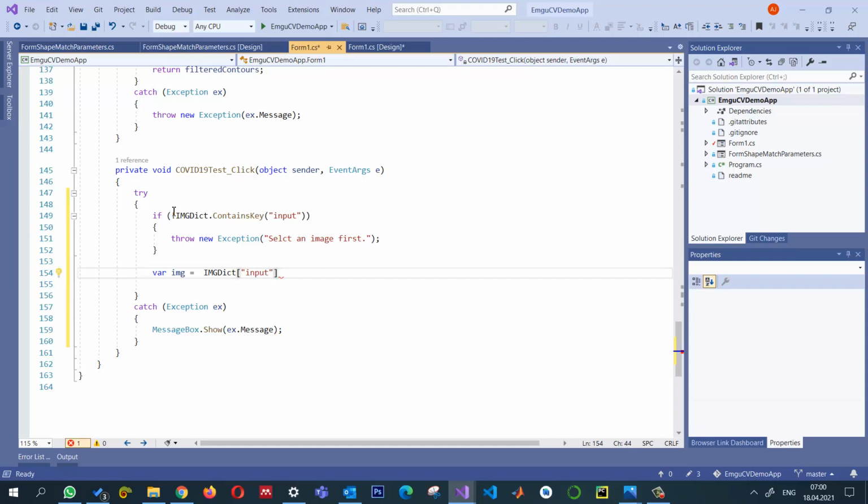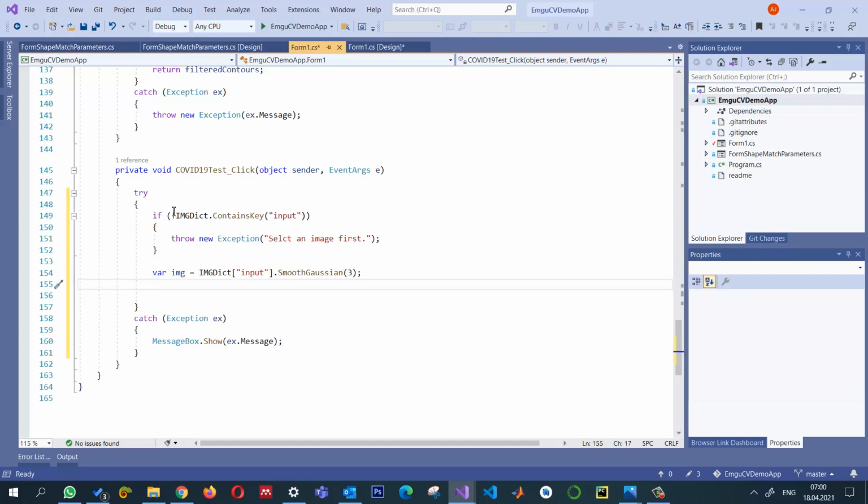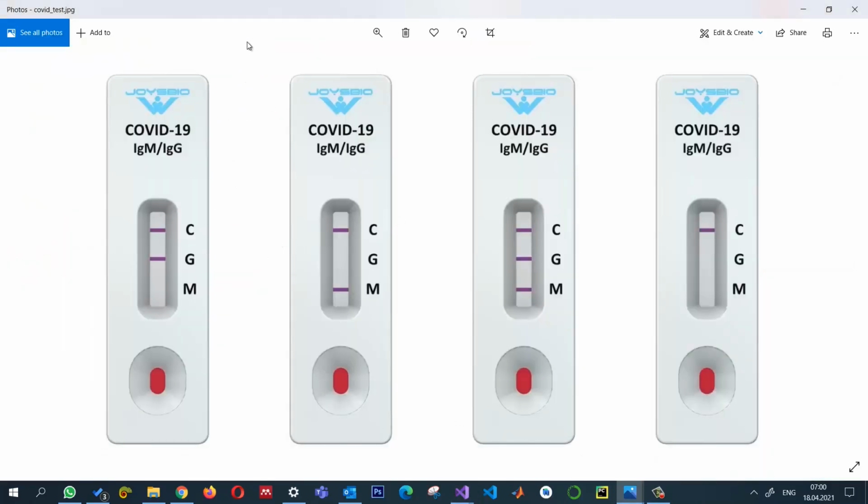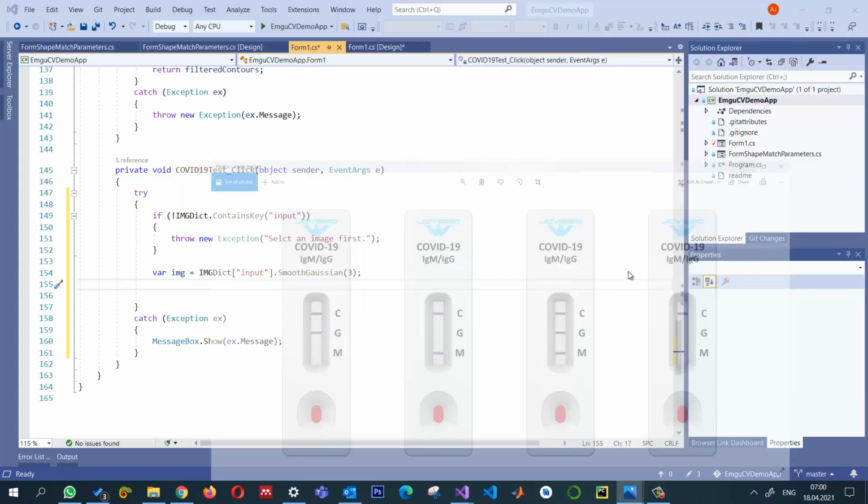And before using it, I would like to smooth it a little bit, so I'm using this SmoothGaussian, and the kernel size I'm using is 3. The next thing is, we can see here this is the image that I will be using. The background, as you can see, is white, so I need to convert it into a grayscale image, and then in fact apply some edge detection to find out the boundaries for these elements. So let's do that.